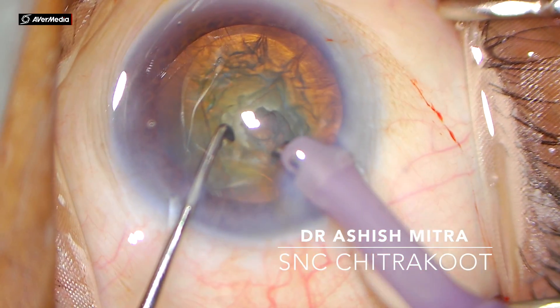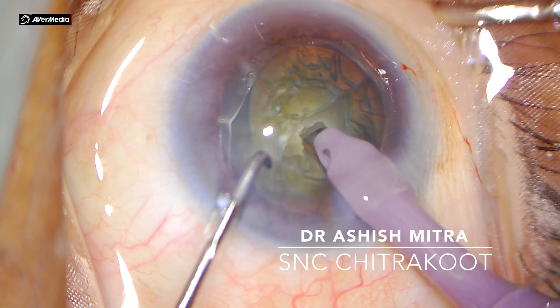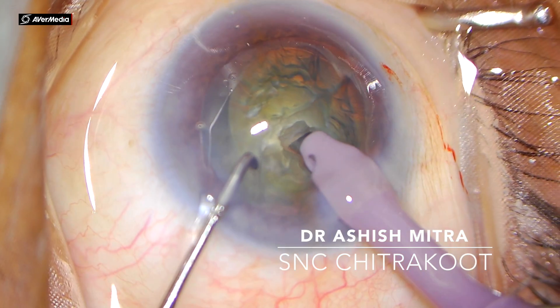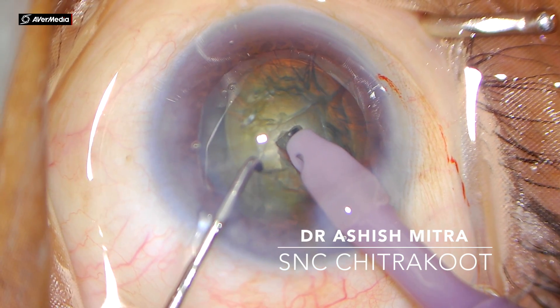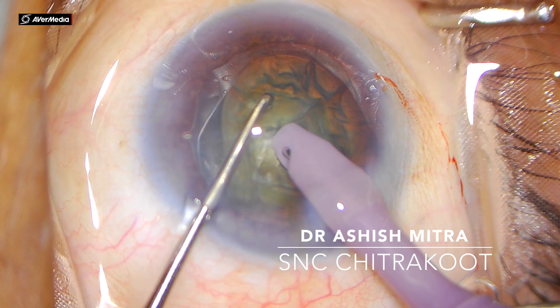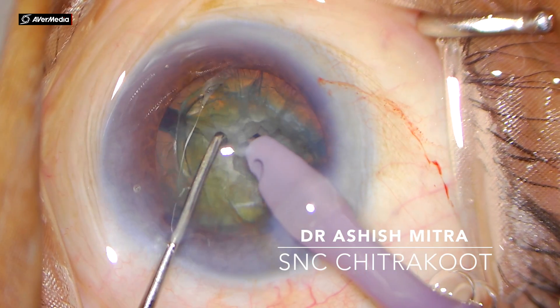Now you can see I'm pointing with my chopper — the glow is visible. This is the superficial area, middle, and deep. I would be burying in the middle and deep zones. Watch as I bury my phaco probe into the nucleus — the phaco probe is buried — then the chopper just in front of the phaco probe, and crack.